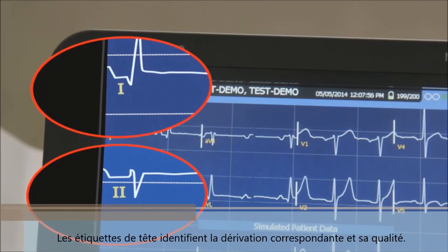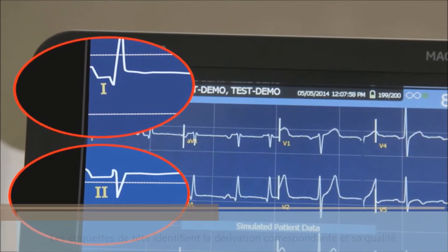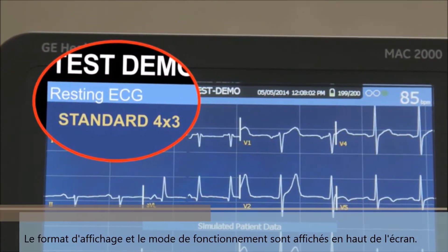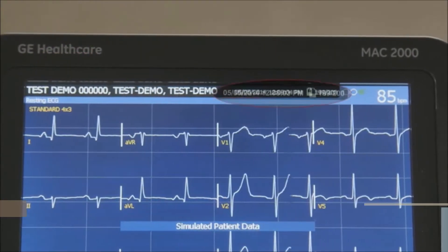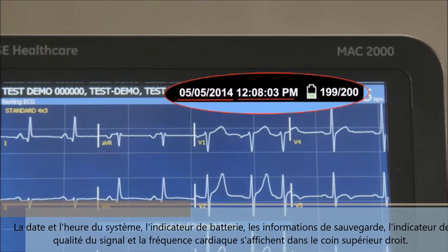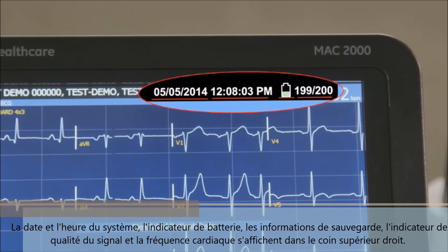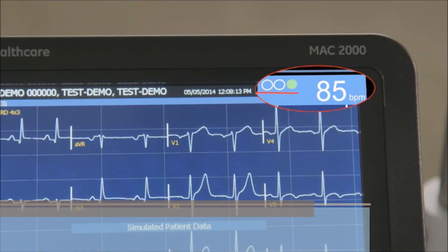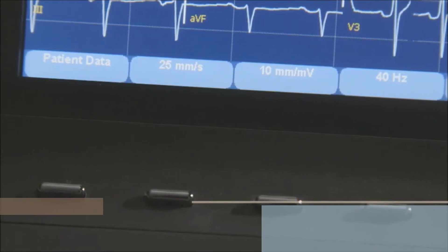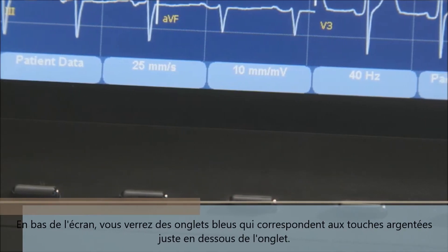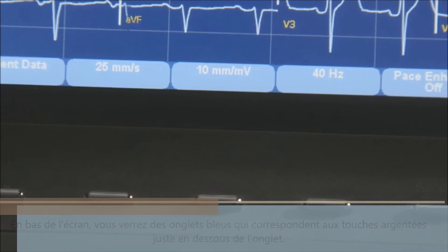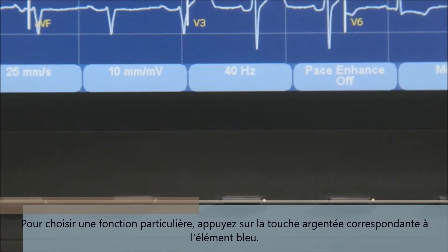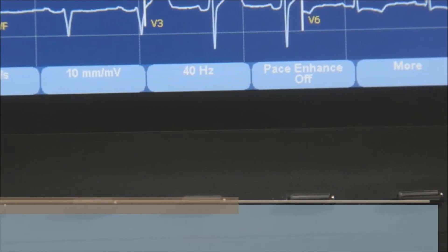The lead labels identify the corresponding waveform and its quality. Display format and operating mode are shown at the top of the display. System time and date, battery indicator, storage information, hookup advisor signal quality indicator, and heart rate are all displayed in the upper right corner. Across the bottom of the screen you will see blue tabs that correspond to the silver keys just below the tab. To choose a particular function, press the corresponding silver key beneath the menu item.